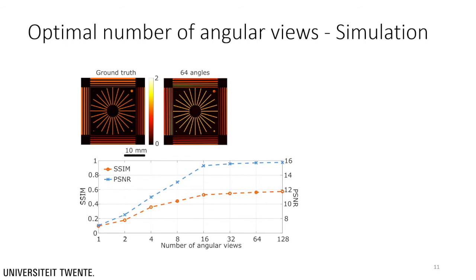It was found from the simulations that 16 angular views are optimal, which is a 22.5 degrees step. For the experiments, we decided to use 18 views, which is a 20-degree step size. This is a slight oversampling compared to the calculated value.